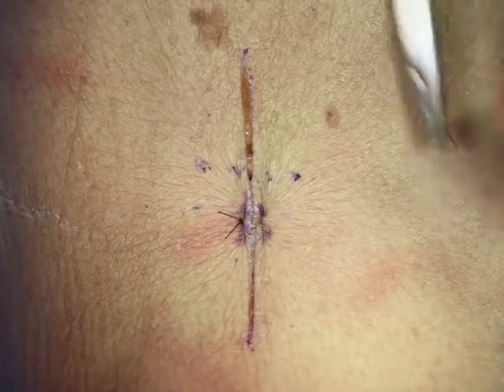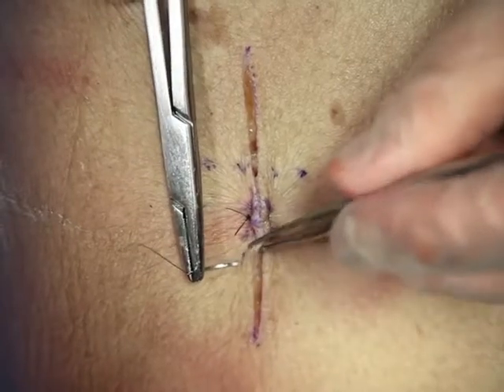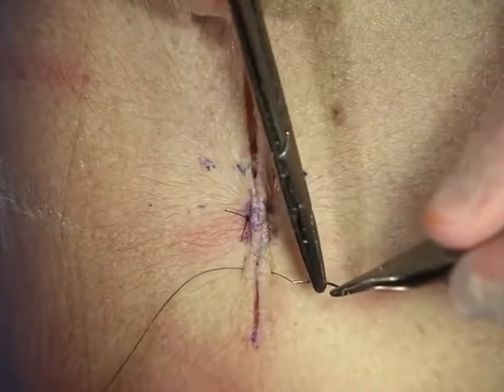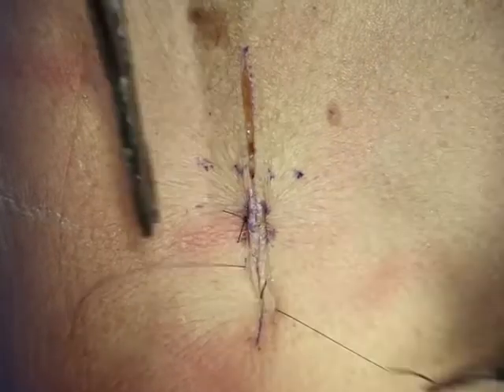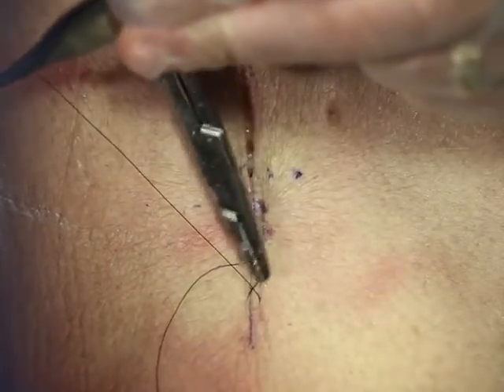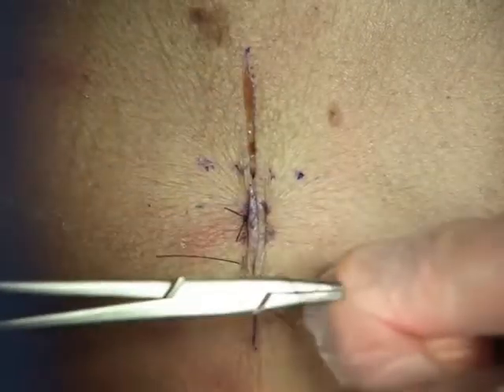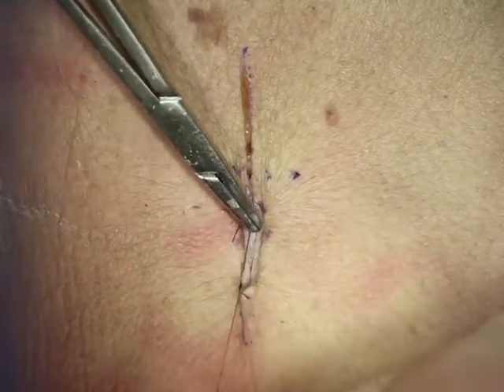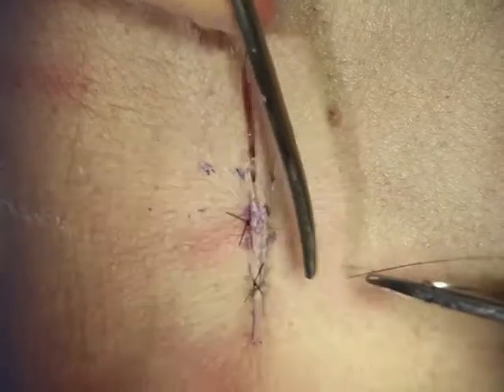A variant of the horizontal mattress is the figure of eight suture. The figure of eight has the same distribution — you take your simple bite and your simple bite, but rather than turning the needle around, you move on and take your next simple bite and simple bite. When you tie this, it makes a small figure eight, which is why it's called a figure of eight suture. The advantage again is speed. You'll see this in some deeper closures like fascial closures, because you're grabbing a large amount of tissue and it'll be more secure.